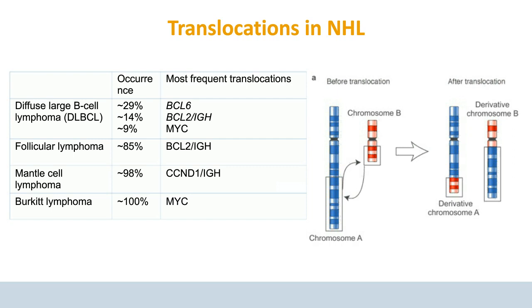It's not every time one exact breakpoint like BCR-ABL or something. With MYC, you have a whole big region, up to more than a megabase or so, where this breakpoint can take place. And as I said, every time there are different partners. We've also tried to put probes on the partners, but very often we do not, because there are unknown partners that we haven't heard about yet.